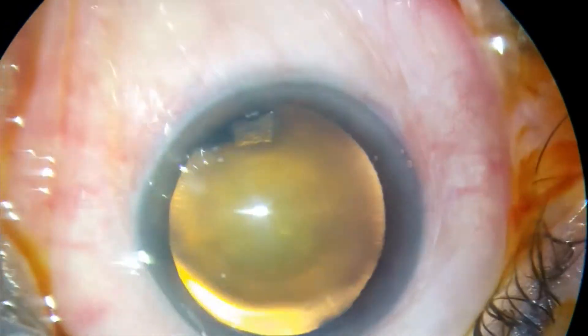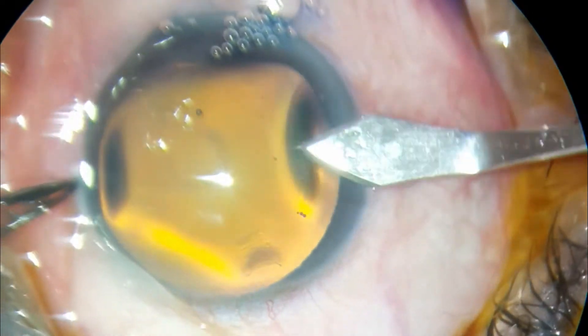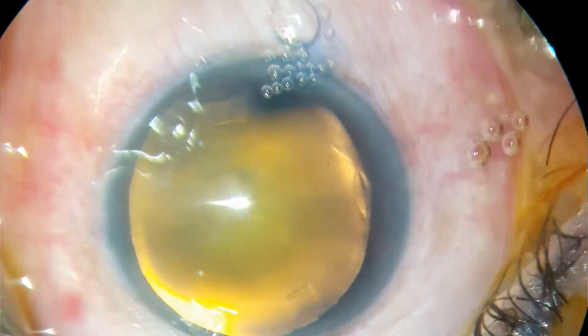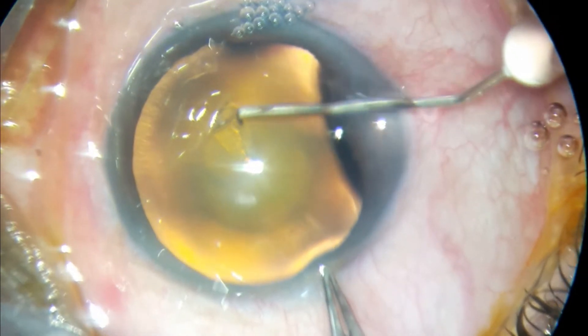Hello everyone, Dr. Jaitra here. This is a case of Grade II Nucleus Sclerosis with Soft Nucleus. Here I will be performing Phacoemulsification Cataract surgery.